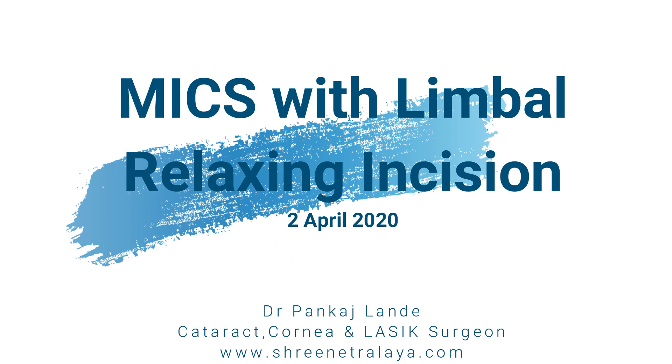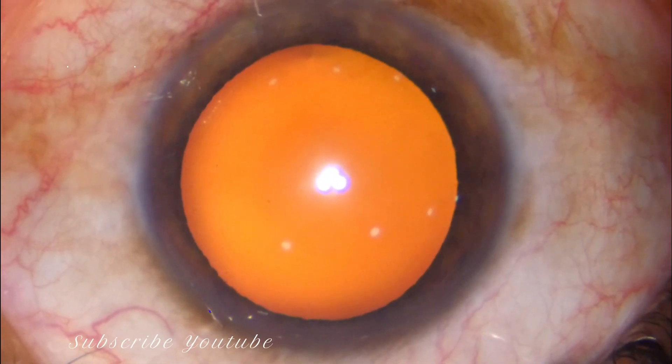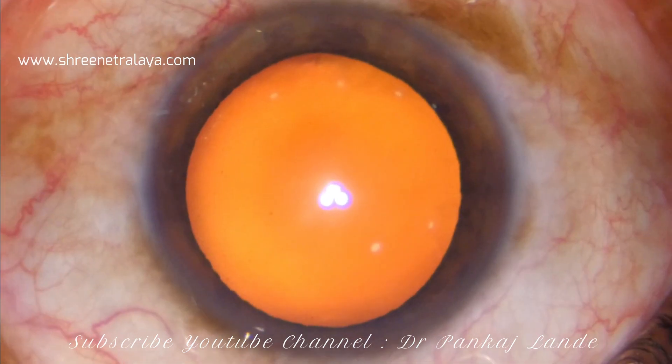Hi friends, welcome to Srinetral. In this case, I am going to show you how to perform phacoemulsification and limbal relaxing incision together.